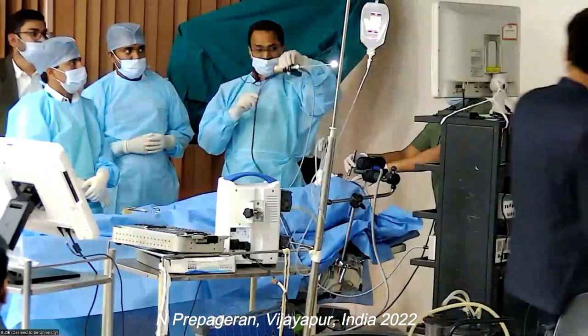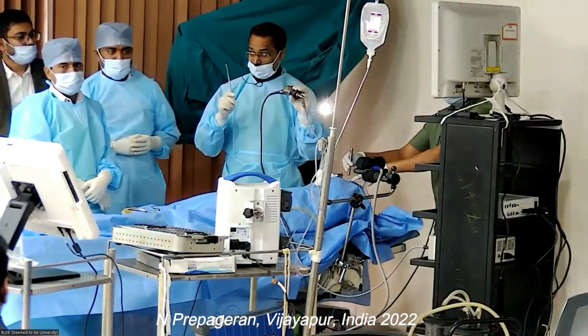The other thing is how you hold the scope. There are many ways of holding the scope, but you want to hold the scope in a way that you're most comfortable, that does not injure your wrist, elbow, and shoulder, where your wrist is completely mobile. So if you hold a scope like this, then your wrist is going to be fixed. You want to hold a scope in such a way that you're balancing it with your thumb, and then you're closing it. So this is completely mobile, step one.